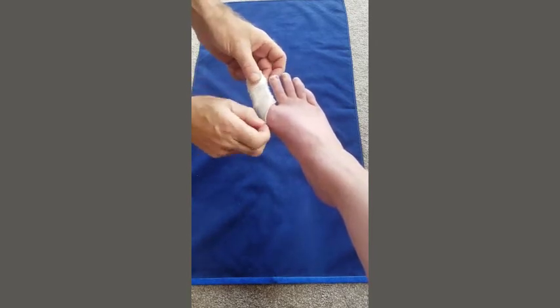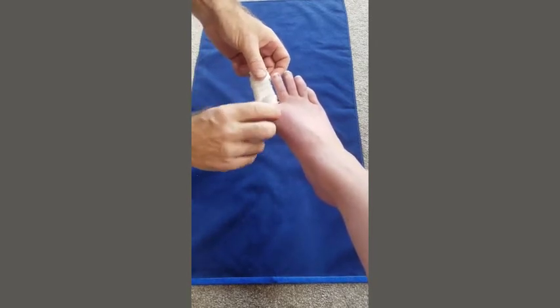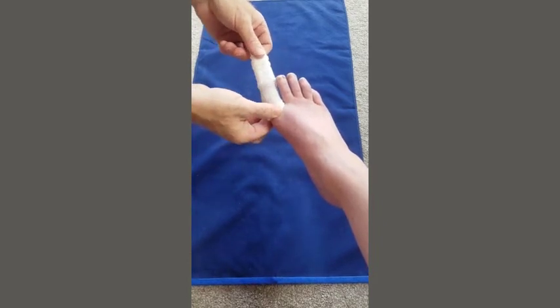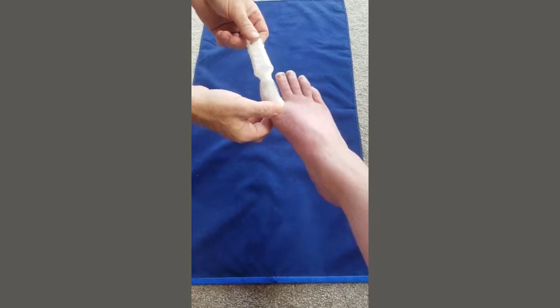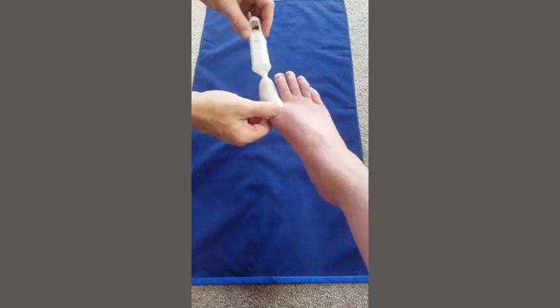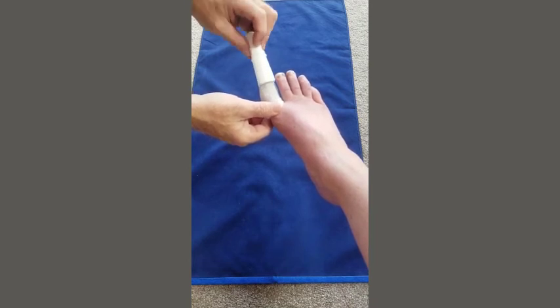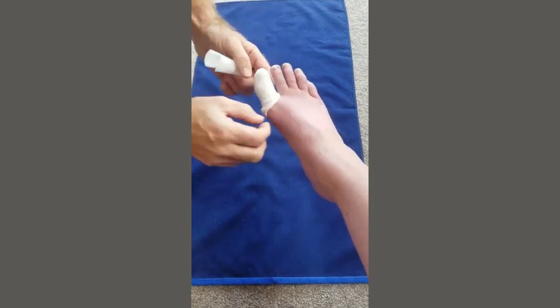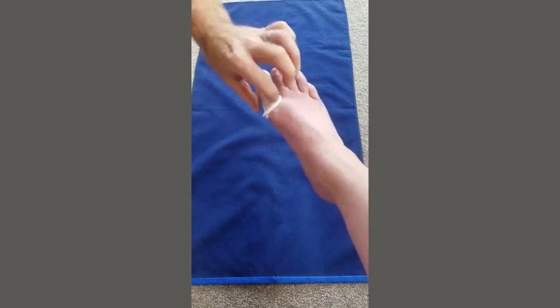Pull that down over the toe, hold that end, and pull off the applicator — you can see it's put the dressing onto the toe. You then give it a good twist around by about 270 to 360 degrees and push it back over the toe like that.